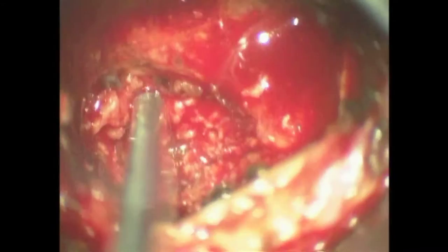Part of the rostral portion of the T11 pedicle was drilled. The discectomy was performed with curettes and rongeurs.